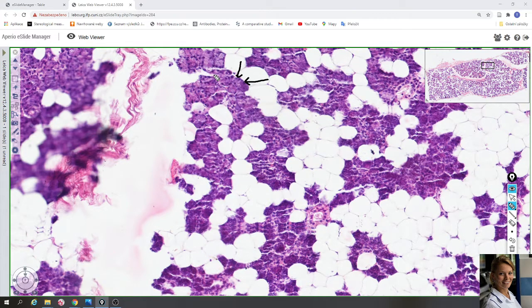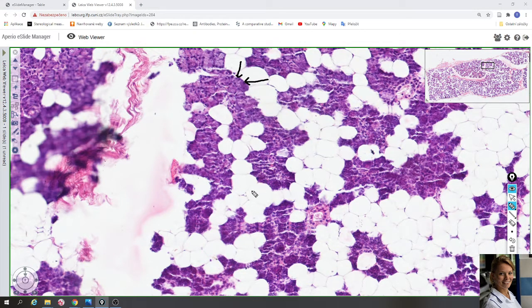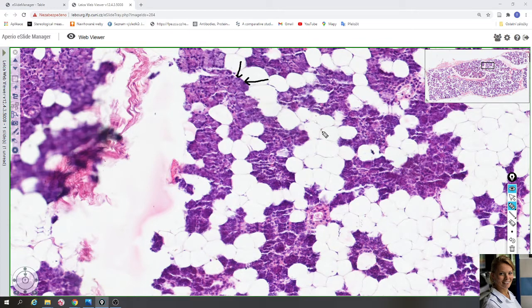These acini are surrounded by contractile myoepithelial cells, though in this case they are not clearly visible. Between the acinar cells there are also many adipose cells. Here you can see only a thin cytoplasm of adipose cells and their peripherally located nuclei.